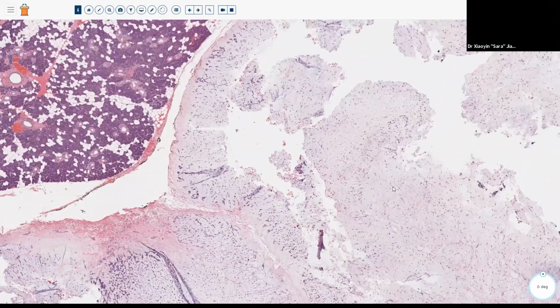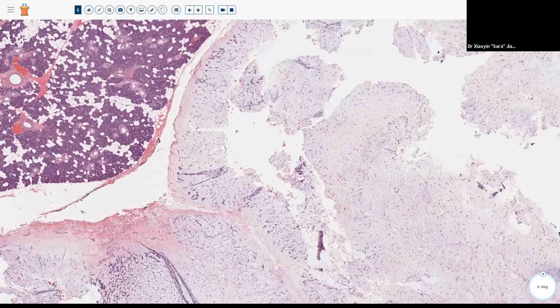The other problem that you have with PAs is the clinical history would be, oh, this person comes in, and this is not what we have on this slide. This is just for discussion purposes. We have a person who comes in, they've had this salivary tumor for a really long time, it's been stable, and then all of a sudden it's had explosive growth, right? And so if that's the board's question, the answer is going to be carcinoma ex PA, and that is pleomorphic adenoma with an epithelial malignancy that arises in it.